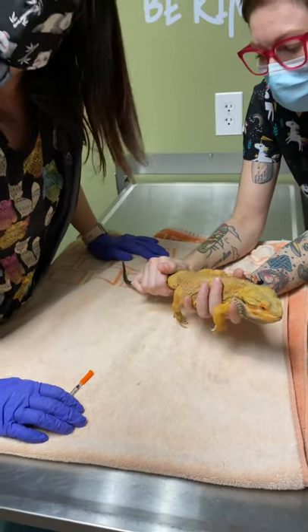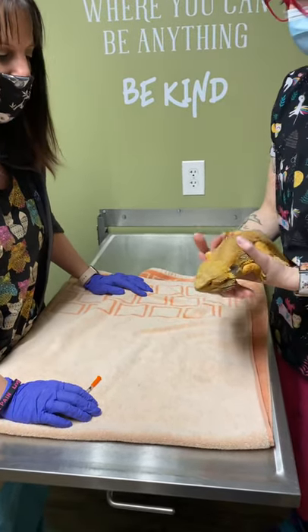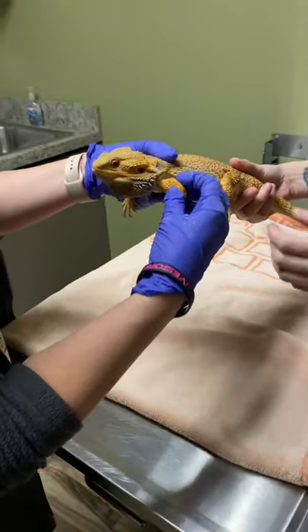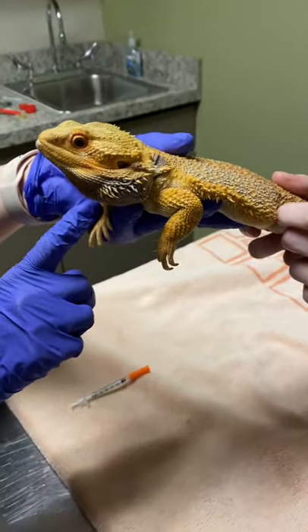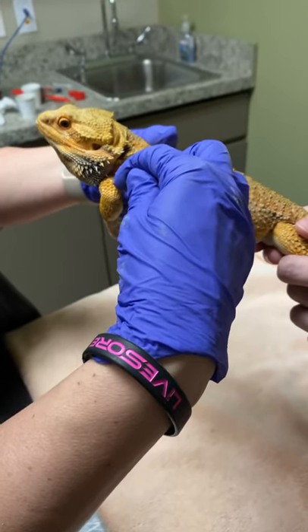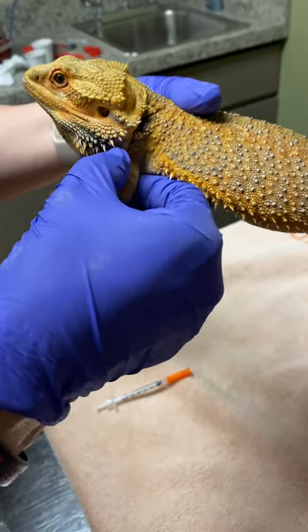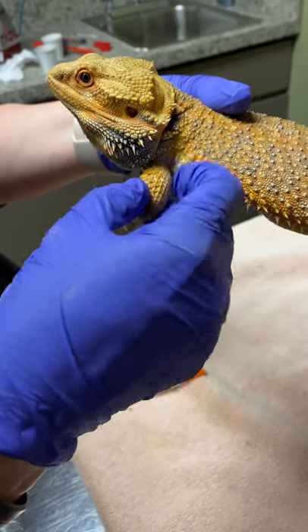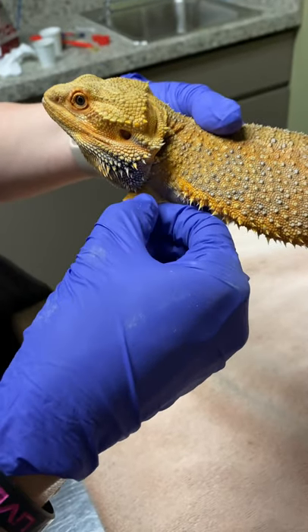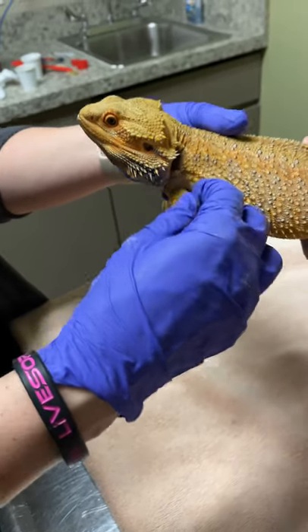It does take two people typically to give injections in a bearded dragon. We do front legs only, and they are wiggly — that's normal. We alternate legs so they don't get sore. We go in between the scales, so you're not going to go directly into a scale. Their muscles are on each side of the bone, usually towards the back, the meaty part — that's the muscle. You're just going to go a little bit in with the needle into there.